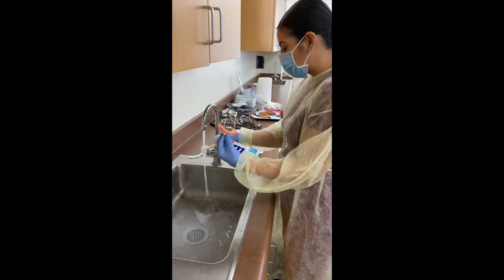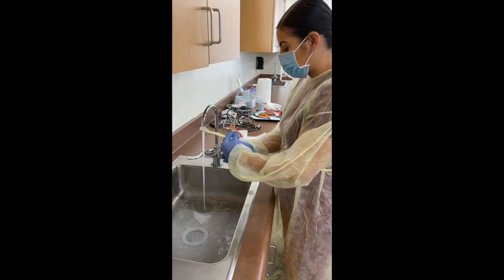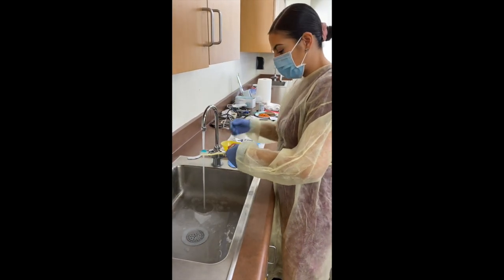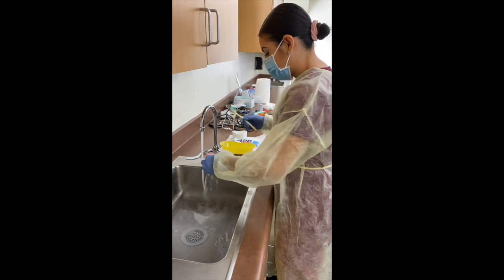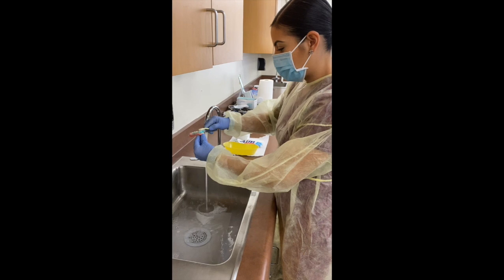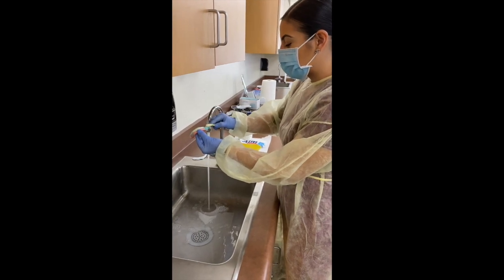I'm just going to wet my toothbrush. I'm doing circular motions.